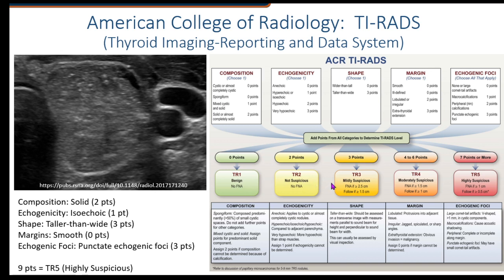Looking at our TIRADS rating, seven points or more puts us at a TR-5 rating — highly suspicious. Then we decide how to approach it. If it is large enough — at least a centimeter — it needs to be biopsied. If less than a centimeter, we follow it. These are slow-growing cancers, so we're not talking about an emergency situation. When they're below one centimeter, we don't do anything until it gets to a centimeter or greater. If it is a centimeter or greater, as this one clearly is, then we stick a needle in there and get a biopsy done.